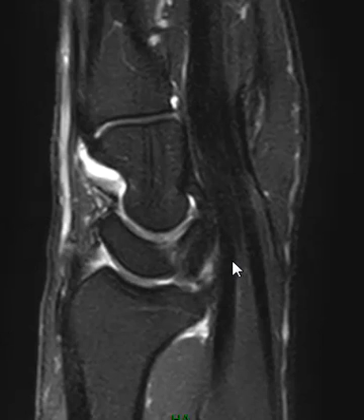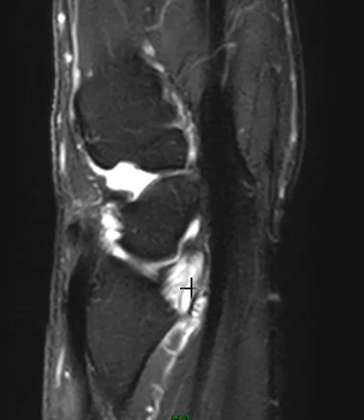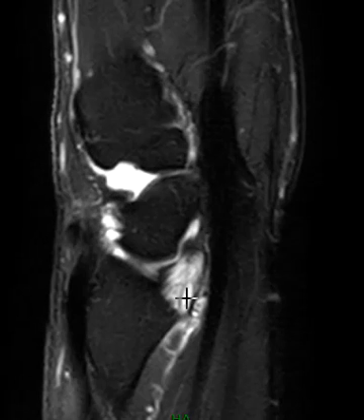Here's that sagittal image — a midline sagittal view. The lunate bone is here, and this is part of that palmar ligament complex. But if we go towards the radial styloid, we see this big puffy area, very bright. Usually this is a dark thick band attaching here, but instead this is really bright.